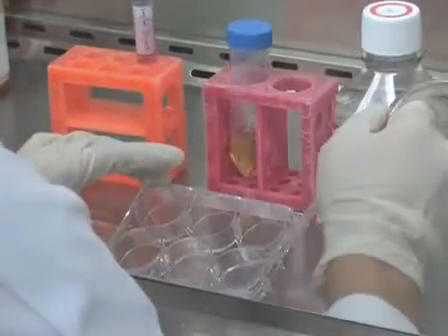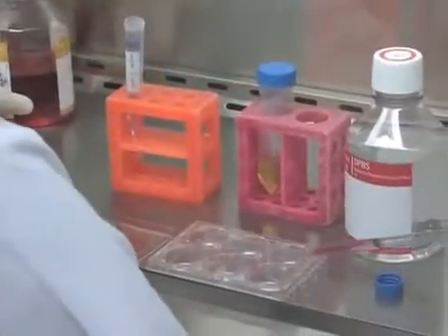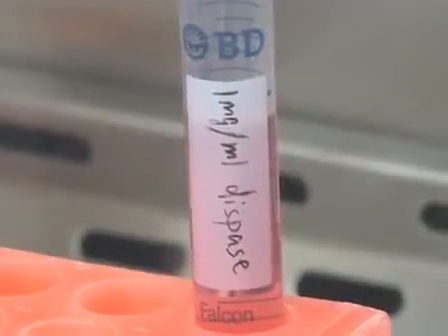Then add 1 milliliter of 1 milligram per milliliter dispase to each well and incubate at 37 degrees Celsius for 3 minutes.